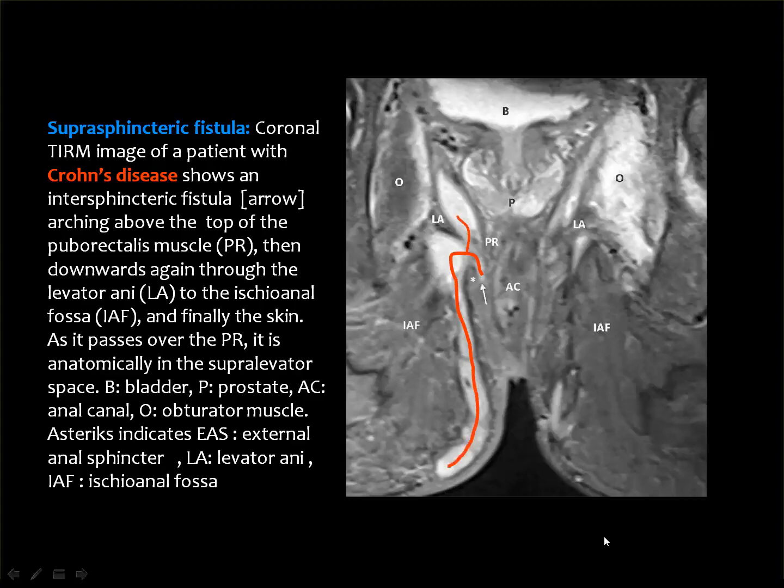Actually, you will feel some difficulties in interpreting anal fistulae, especially in the complicated cases. But if you persist in learning such an area anatomically and pathologically, then you will gain your own experience and your own reporting style for this particular disease.